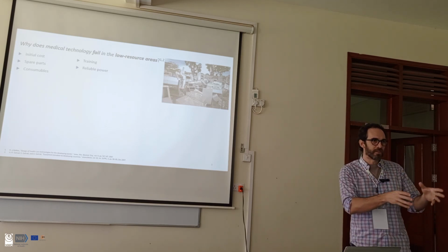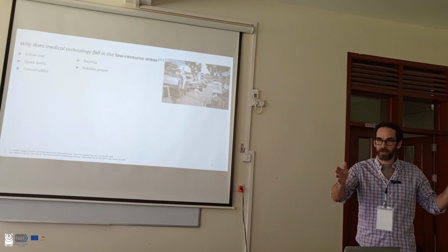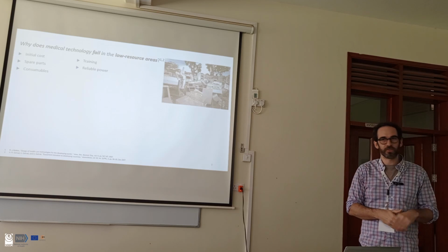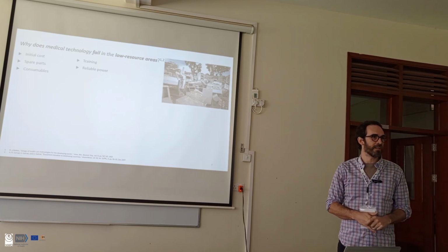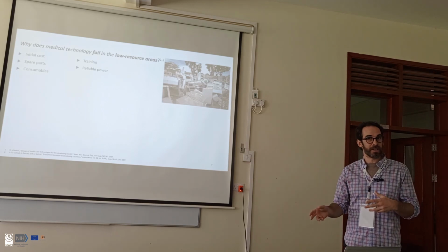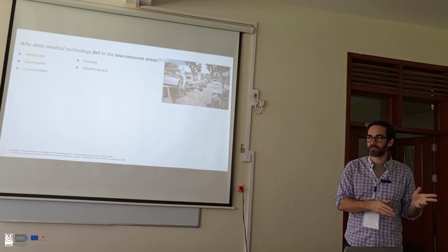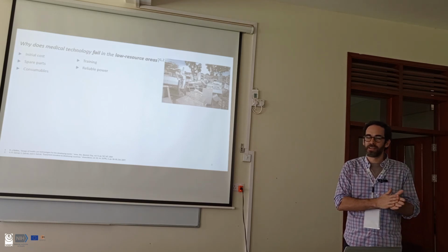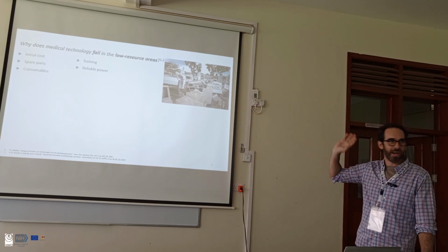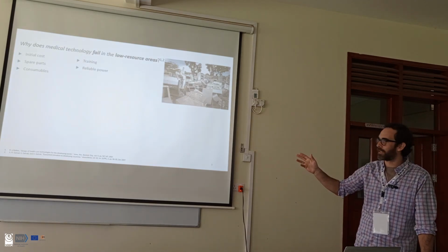But they'll send them to these hospitals, they'll train them in biomedical engineering for a few weeks, give them some language courses if they need it, and then they send these folks into the hospitals to help fix equipment and document what's going wrong. This is something that we often don't do, right? And so they've curated all this data on why the technologies are failing, what's going wrong, which technologies are failing.